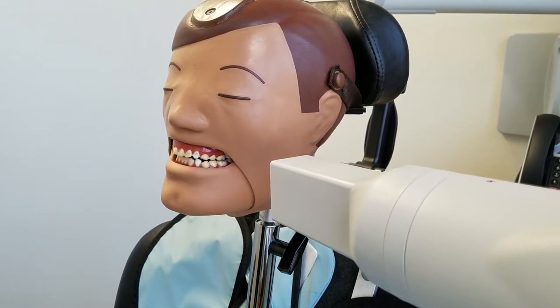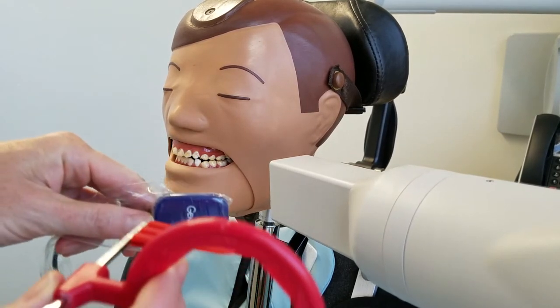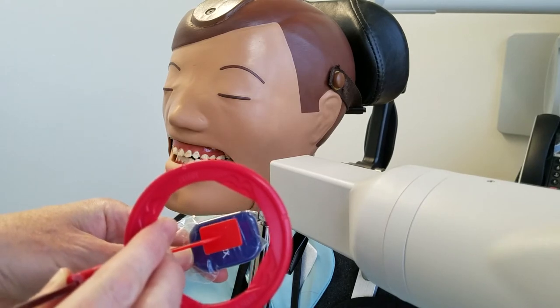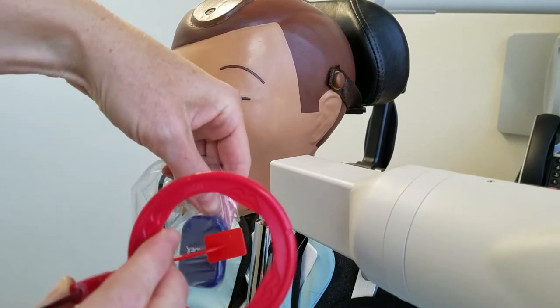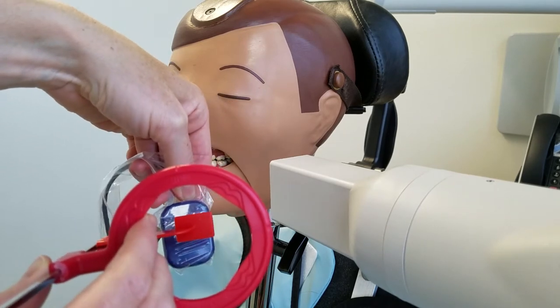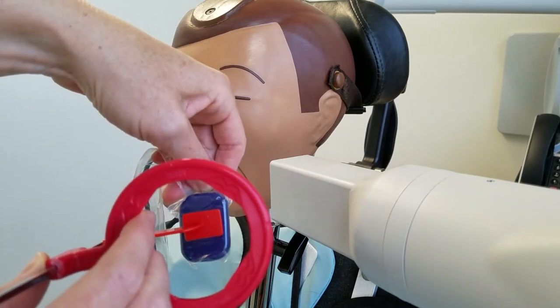Now we're going to demonstrate vertical bite wings. For a vertical bite wing, instead of setting up the sensor horizontally, you just turn your sensor up and down — your sensor is vertical as opposed to horizontal. So you're just going to turn your sensor.